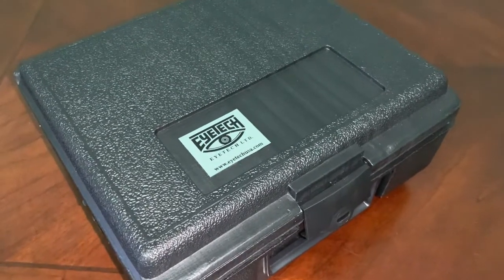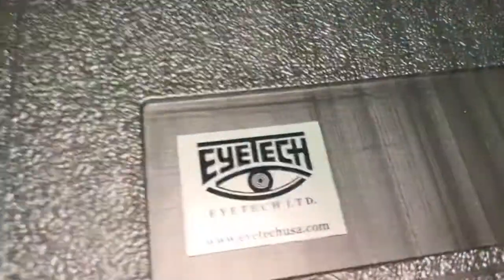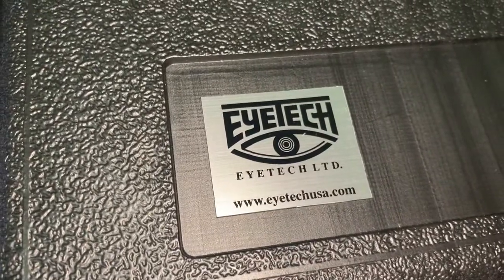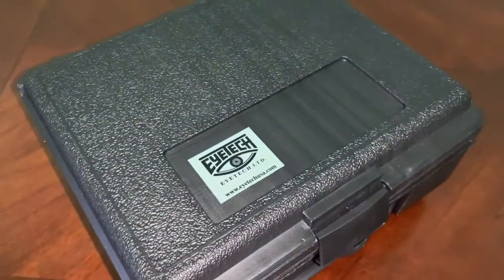It is a device to teach Goldmann Applanation Tonometry. These are available from Eyetech Limited, which is eyetechusa.com. It's the only place I know to get them, and I've bought multiple ones from them.